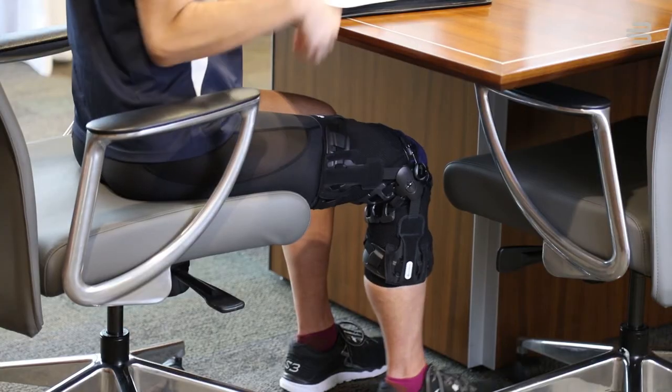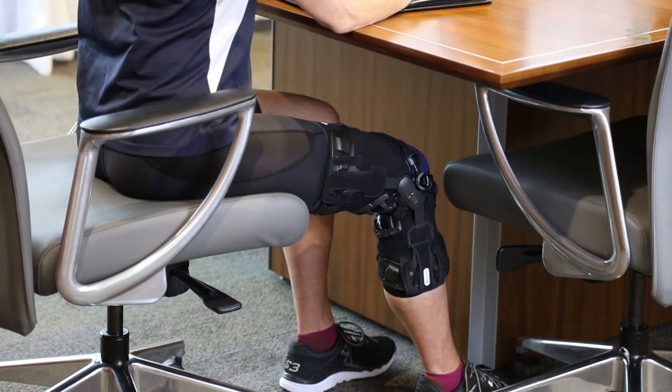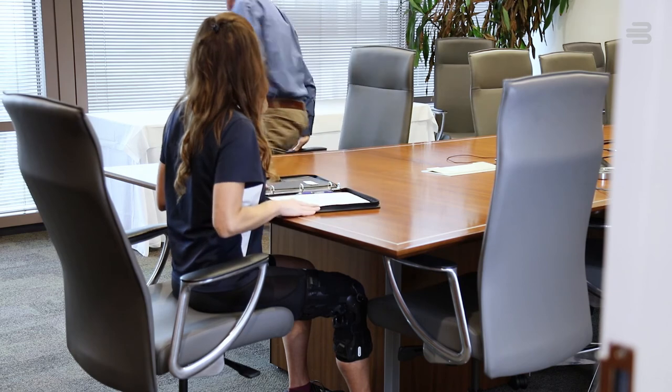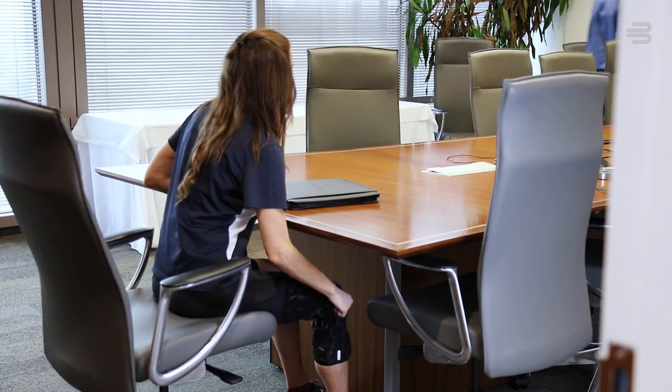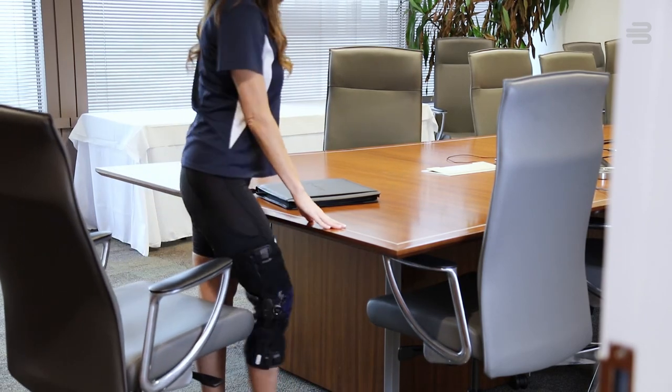For maximum comfort during the day, we suggest disengaging the BOA Fit system when sitting for prolonged periods of time, like in a car or at the office. When it's time to get up, simply re-engage the system by pushing the dial and tightening it to your preference. This can be done while wearing your regular clothes over the brace.